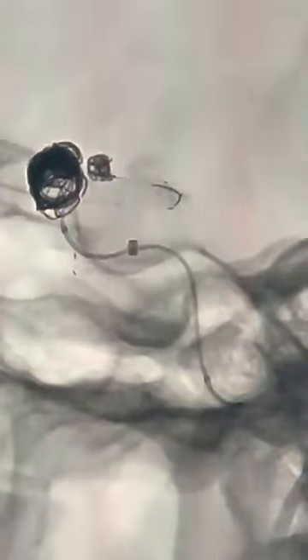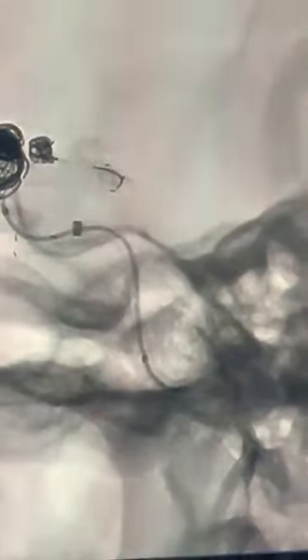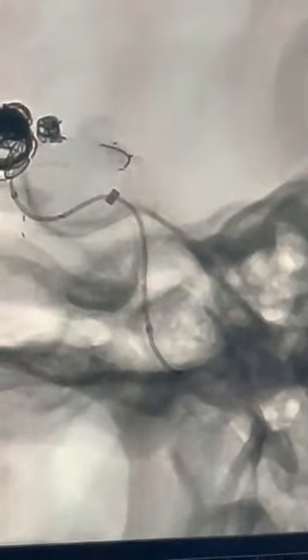So we can resheath and redeploy it a little distally. This is also fine.